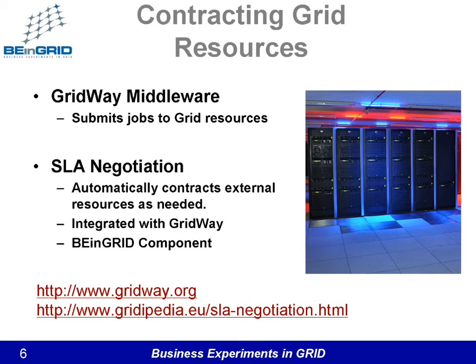In RadiotherapyGrid, the GridWay middleware is used to control the submission of jobs and enables the sharing of multiple resources over administrative domains. To guarantee resources for hospitals, RadiotherapyGrid uses the SLA Negotiator component to automatically contract resources from a grid provider using service-level agreements.